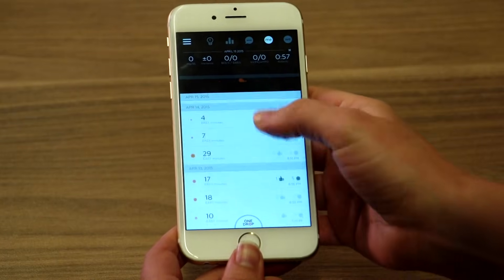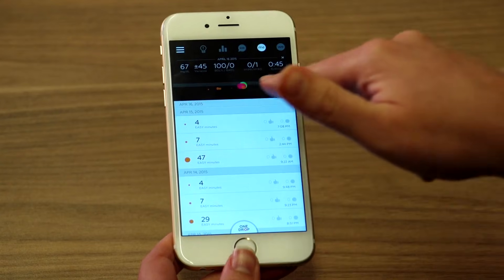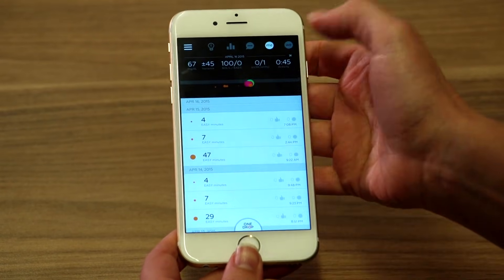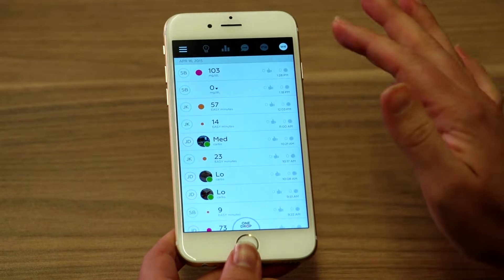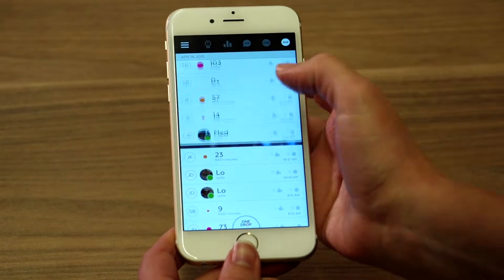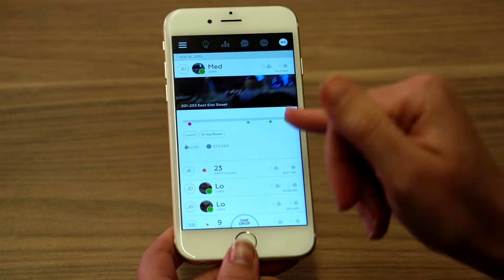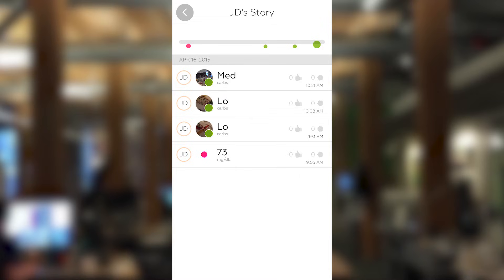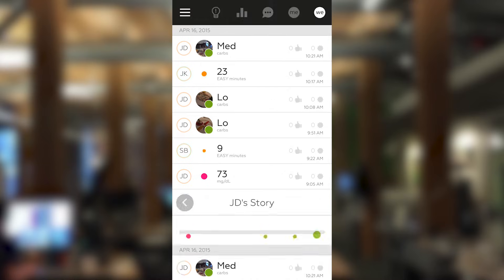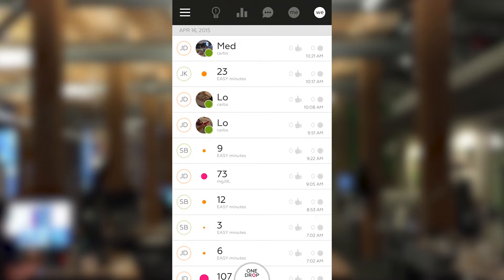It lets you know why certain spikes have happened. It has a little timeline where things show up to show you what you've been doing. There's also a We section where different members of the community share their information and what's been going on. So this person had lunch in their room — you can see they've had a medium amount of carbs, then a low amount of carbs, and you can see what their glucose levels are at that time.